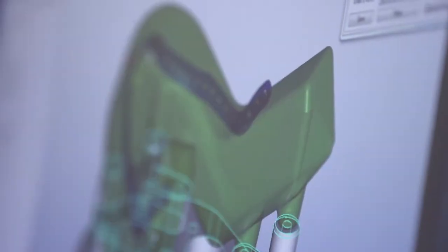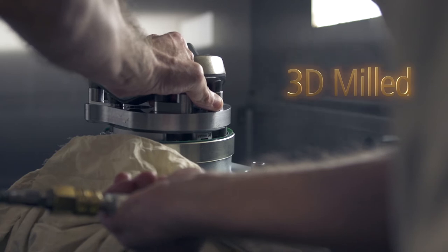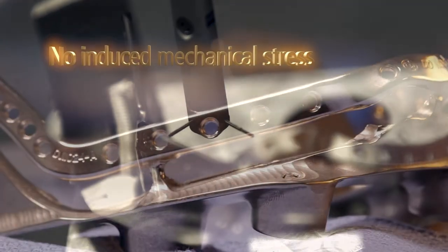The patient-specific plate for mandible is milled from a solid block of titanium and never bent, eliminating induced mechanical stresses as seen with other plates that are bent to final shape.